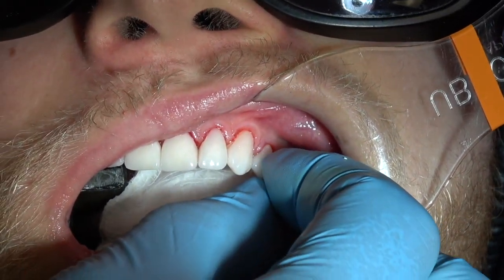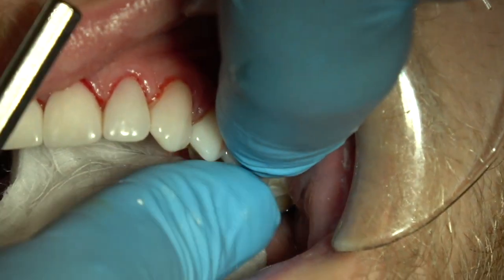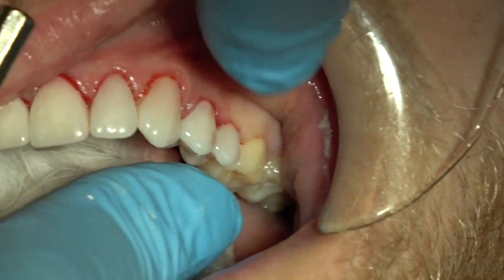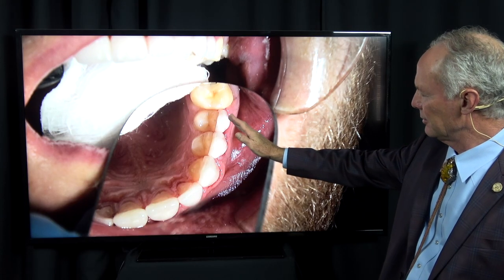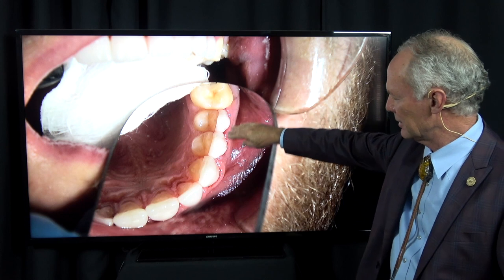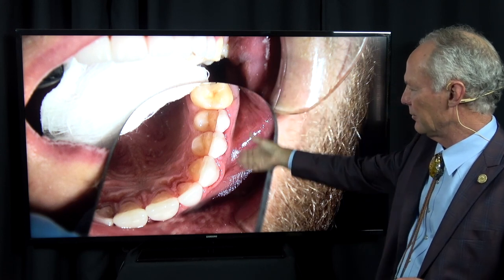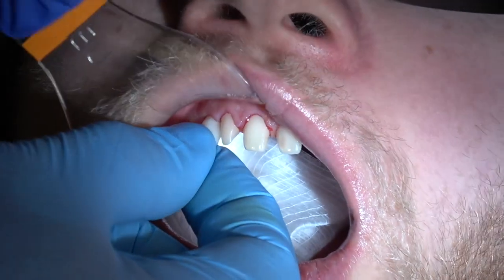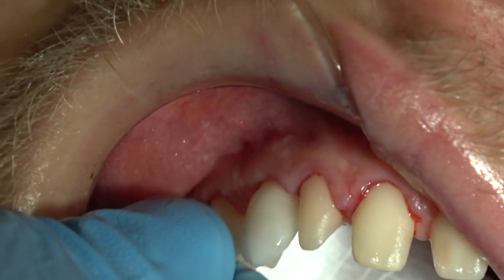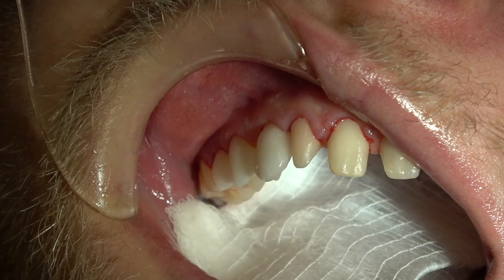See, with the bicuspids, I've got to stop because I've got that lug cut into the facial occlusal surface. It doesn't actually extend onto the occlusal. It's just in the facial, so when I seat it, it has a stop. If you've only prepared the facial, if the veneer is only on the facial, that's a nightmare because it's going to swim. It's not going to seat distinctly. I'm going to try them in.